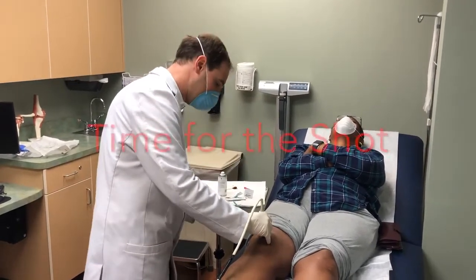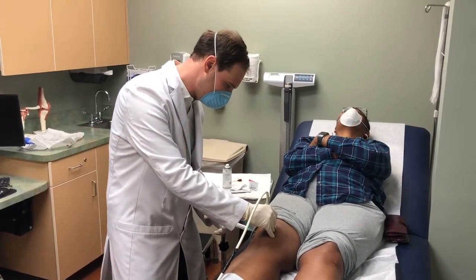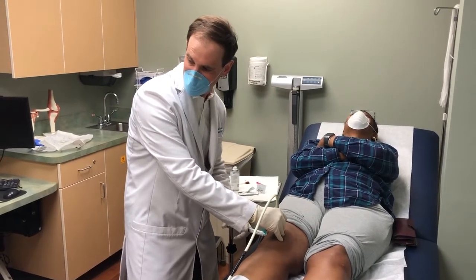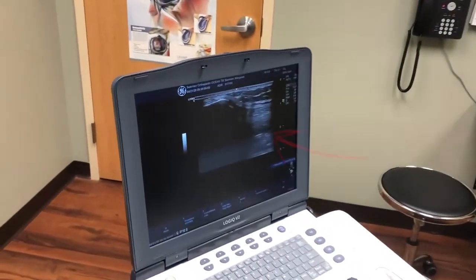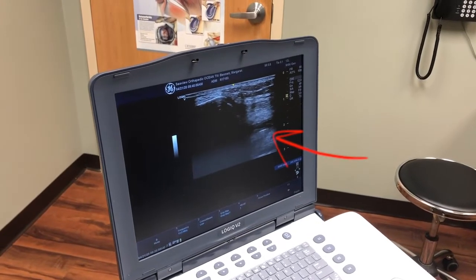Here's the injection, administered while watching under ultrasound. And if you look at the ultrasound, you're able to see the needle and the fluid filling up as it goes into the joint.